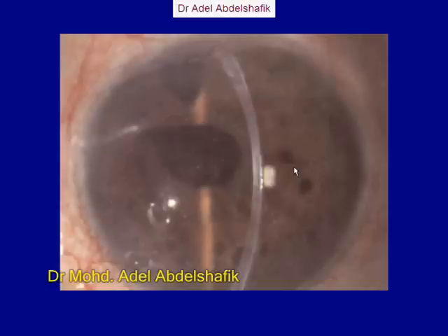Clinically, how would you differentiate between corneal scar and corneal edema? Both will make the cornea hazy. I cannot see through the cornea. How to differentiate? The thickness. If I make a section and I find that the cornea is thick, then this is edema. If the cornea is normal thickness or thinner, this is scar tissue.